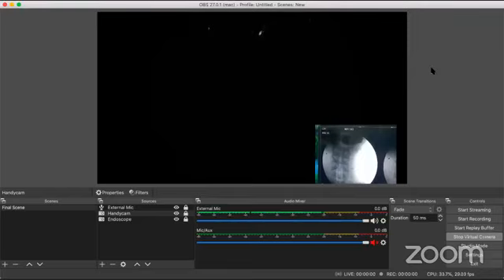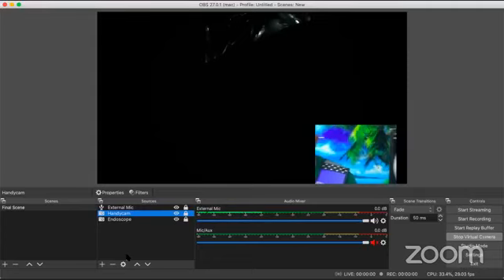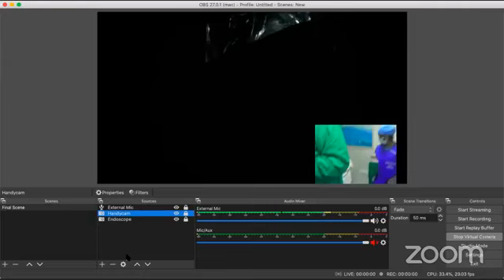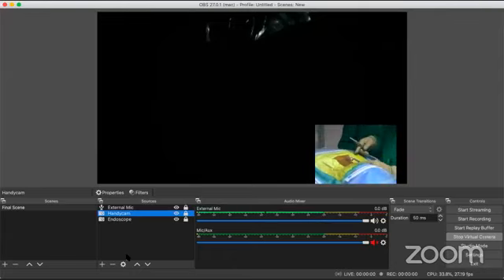I'm putting in some infiltration into the wound. Okay, thank you. And now can we take the C-arm back, and can you please focus here? Now I need a scissor and a forceps. We are going to make sure we don't carry any plastic with us into the wound. So I'm going to strip this a little bit at the point of my cut onto the skin.